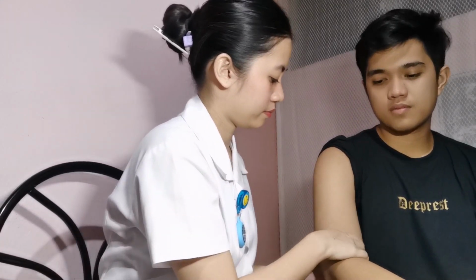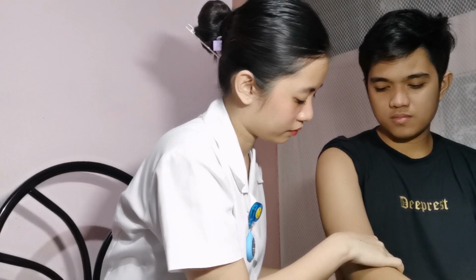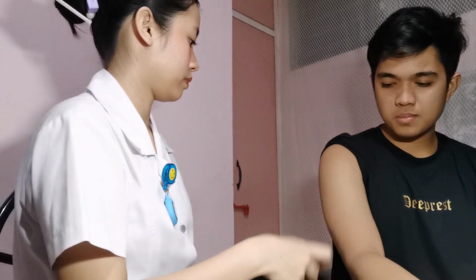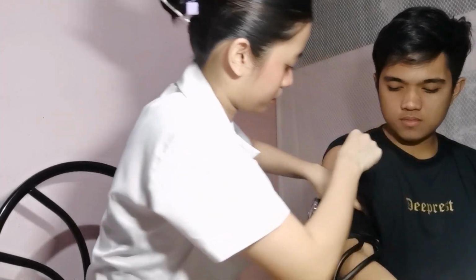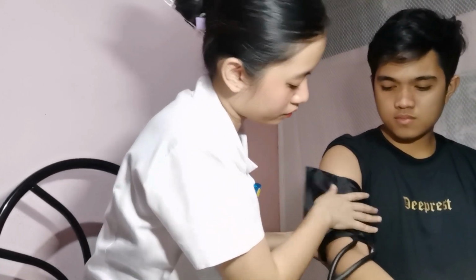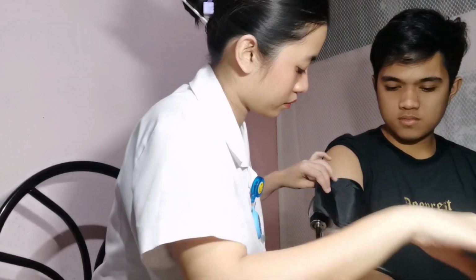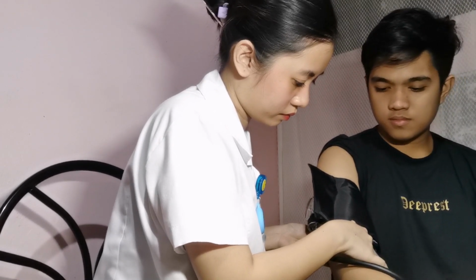The position of the arm allows easy access to the brachial artery. Position the gauge so it can be easily visualized.